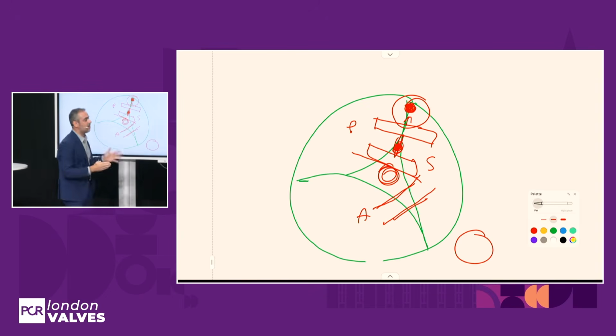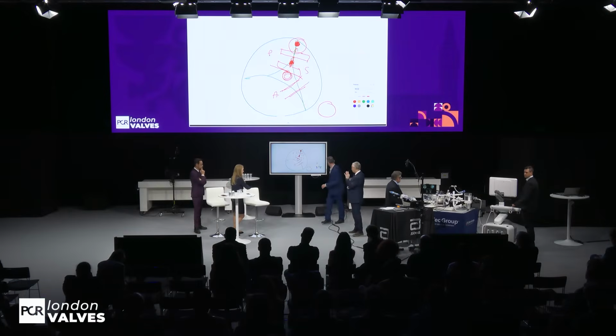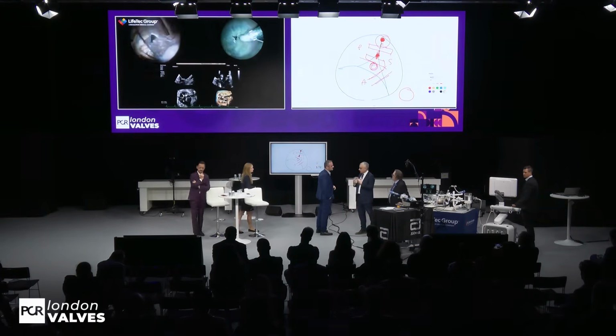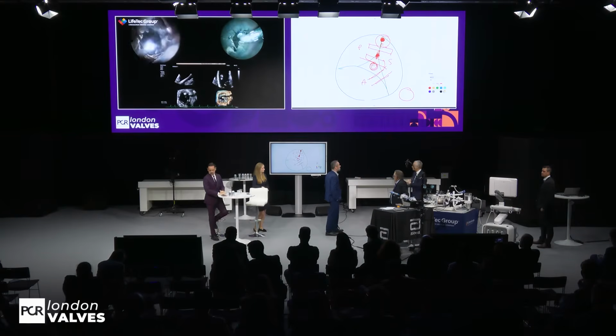So let's go back to the model. But I want to warn the audience, you can also damage the lead by doing this maneuver. You are scratching on the lead. We have been trying a lot to do this, but there are some challenges there. So I will do what you tell me.